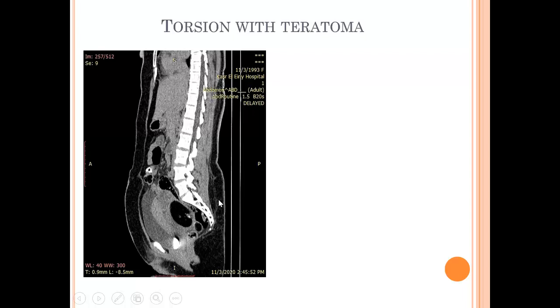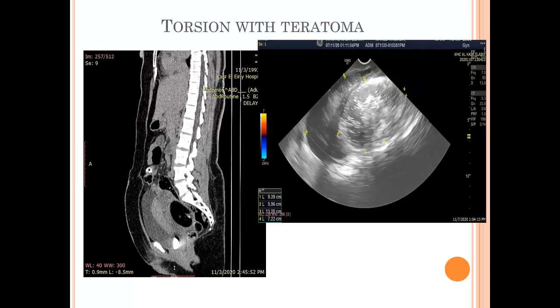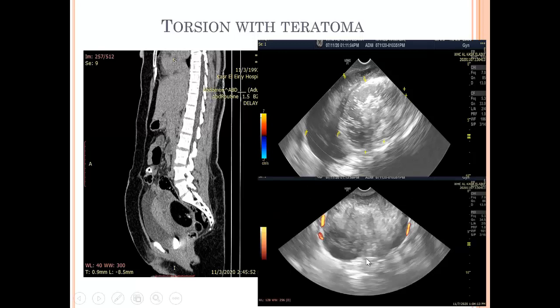This is a case of torsion with teratoma presenting with acute pelvic pain — CT was done showing a teratoma with fat density, calcification, and Rokitansky nodule. There is an associated enlarged ovary with soft tissue component. On second-look ultrasound, this is the teratoma showing the dot-dash appearance of mature cystic teratoma, and the surrounding ovary appears hypoechoic — characteristic for torsion. There is also absence of vascularity and peripherally located follicles in the rest of the ovary, confirming torsion on top of mature cystic teratoma.